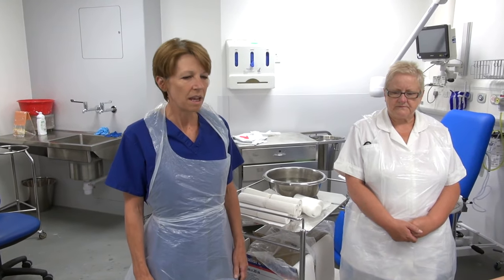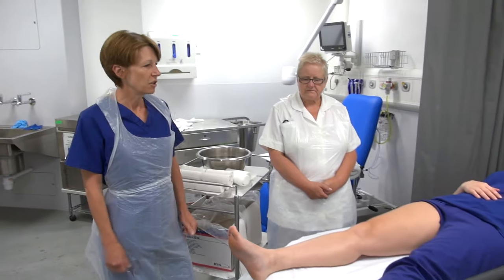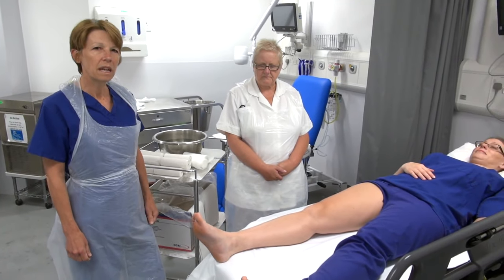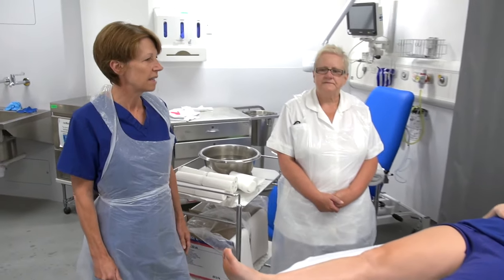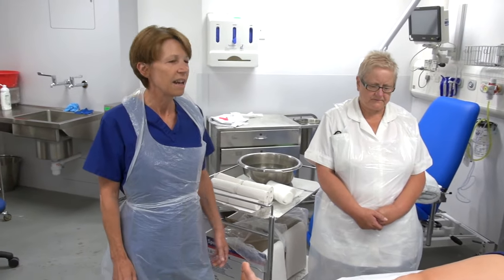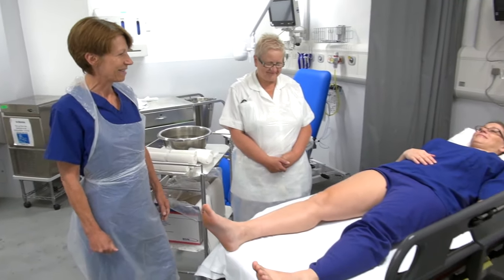Good morning, I'm Sue. I'm one of the clinical support nurses in the emergency department and this morning we're going to do some advanced plastering. Our first demonstration will be an above knee full cast. We've got our plaster technician Pam who's going to assist and demonstrate the technique, and we have Anne our model for today.